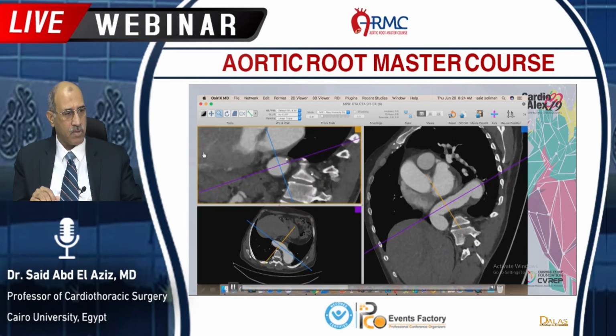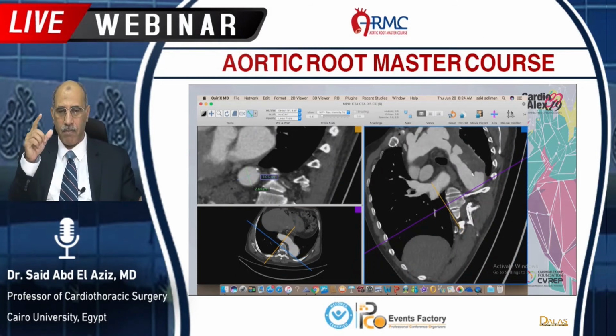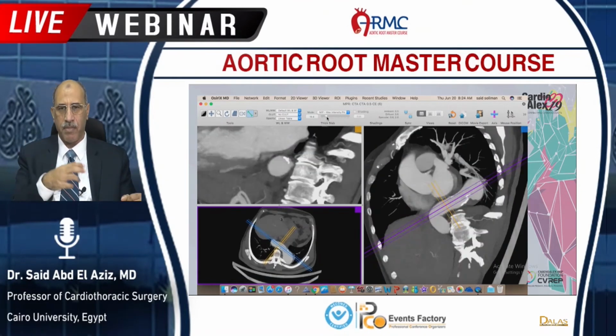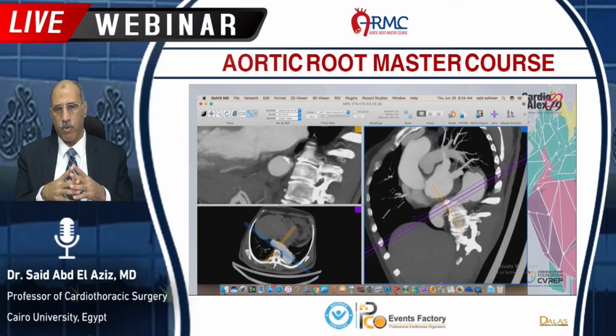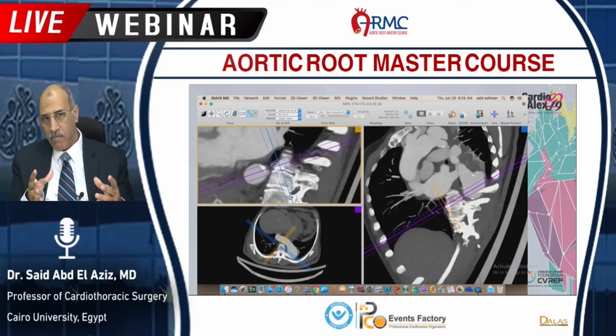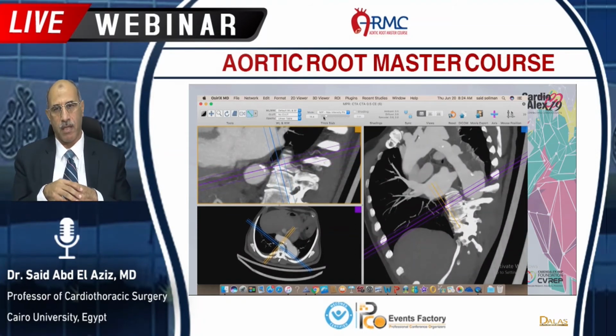Yes, now it is a good circle. We will measure this. It is 26 by 30, so its average is 28. So we have a proximal landing zone 40 and distal landing zone about 28 or 30. So in that patient we can use a stent 40 or 42 down to 34.